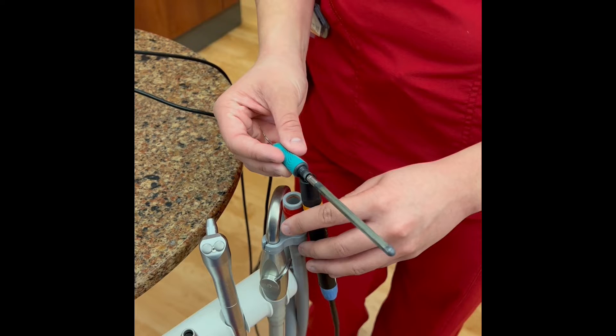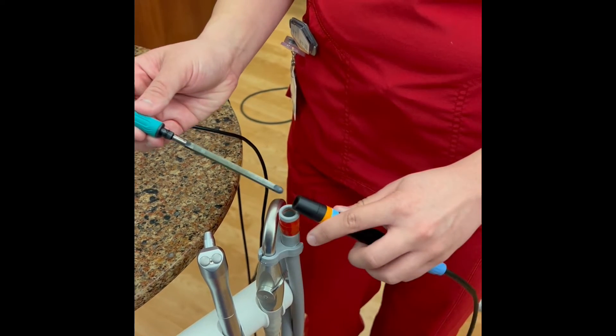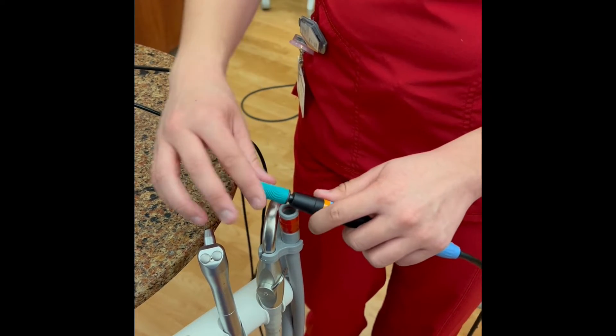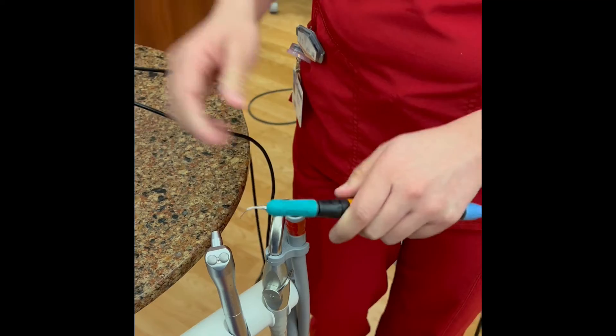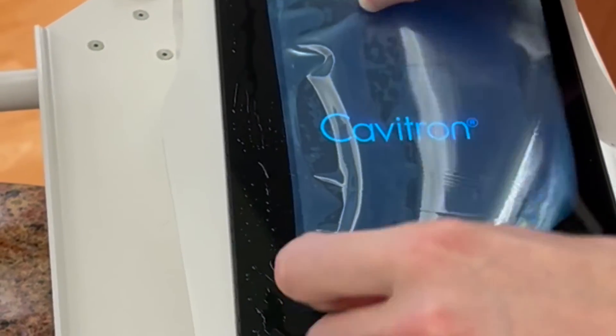Roll the O-ring on the insert in the water bubble to lubricate. Once the O-ring is lubricated, you can connect the insert. Place a blue barrier over the controls and it is ready to use.